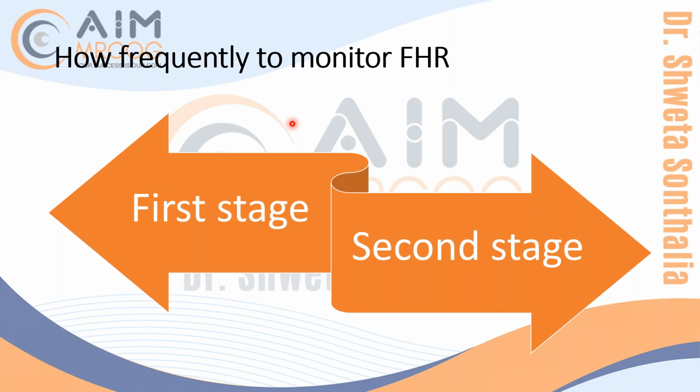Hi, Safia. If you're monitoring 120 on your monitor, the Doppler, not on the CTG, it's a bad thing. Bad because of the possibility of loss of variation. One possibility is loss of variation of the fetal heart. And what is the other possibility? Absence of acceleration. Pardon? Maternal pulse could be.